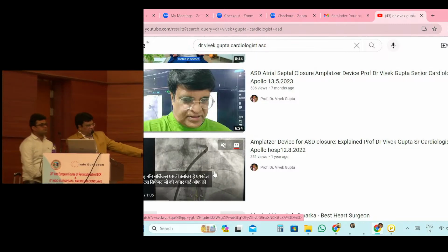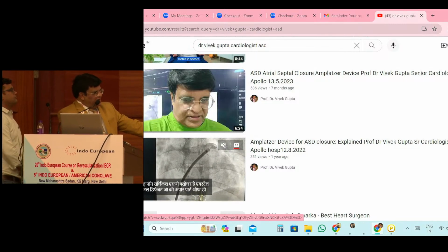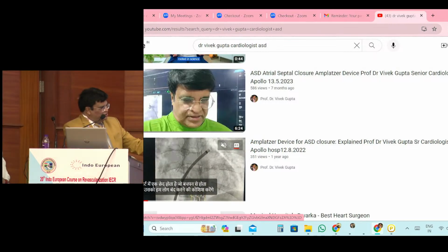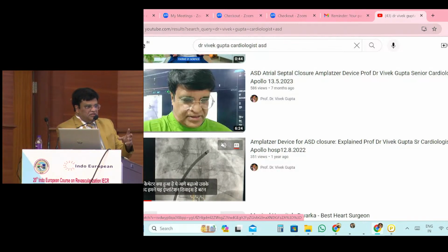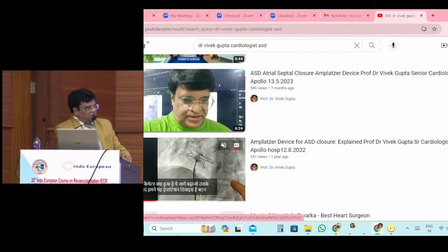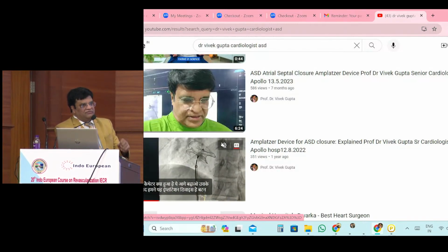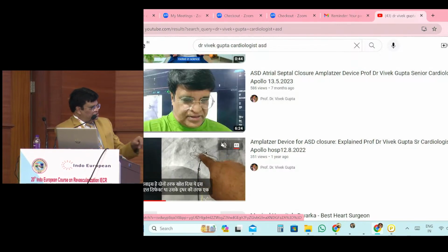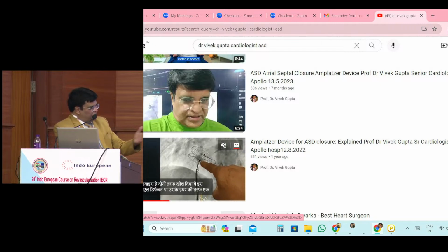Dr. Kapoor, comment, because he has been doing a lot of echoes, and just one quick comment about rims. How do you diagnose the rims are adequate? Because the most important limitation of doing a non-surgical device closure is the non-adequacy of the rims around. So can you just elaborate, with the interest of the audience?